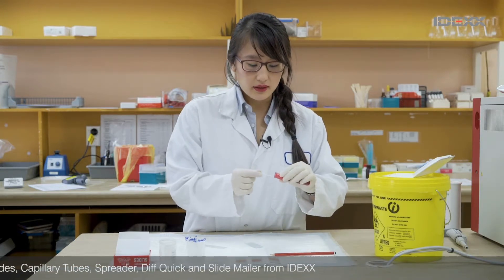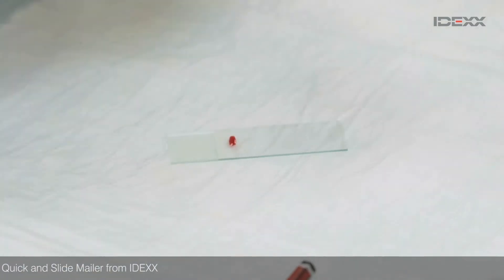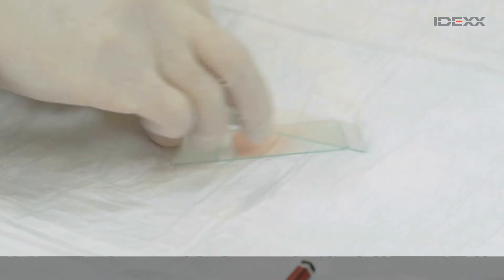So I'm just going to go ahead and show you again. Take your blood, pop in the capillary tube, pop it at the end of your slide, pull back and just push forward.